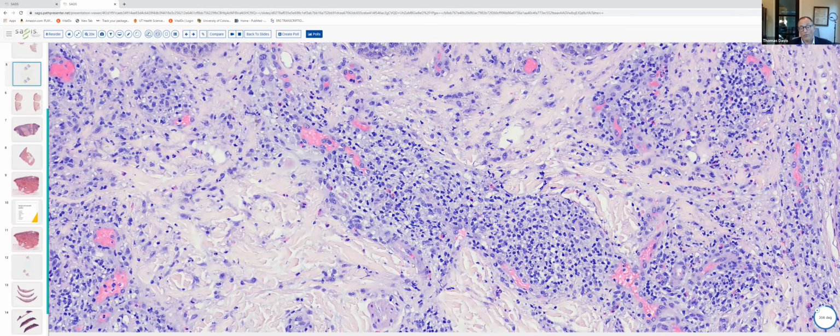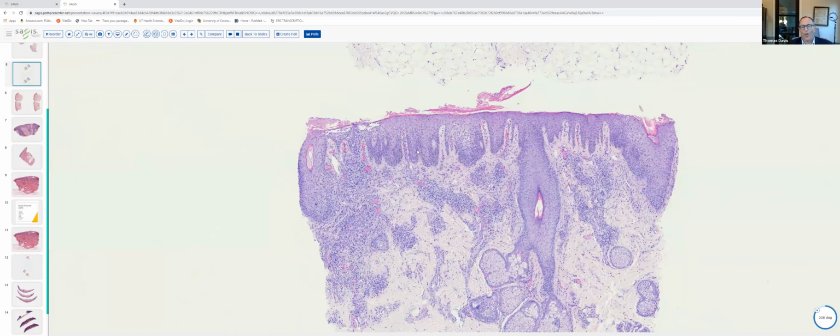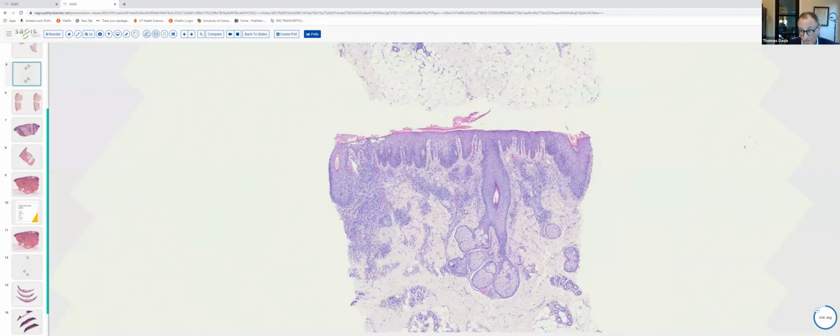The infiltrate here clearly is a little bit more robust than we saw in slide 1. And again, we have epidermal hyperplasia and scale crust within the stratum corneum. The differential in this diagnosis, in the absence of clinical history, would include subacute to chronic allergic contact dermatitis, nummular dermatitis, a drug eruption, possibly even an id reaction, atopic dermatitis.